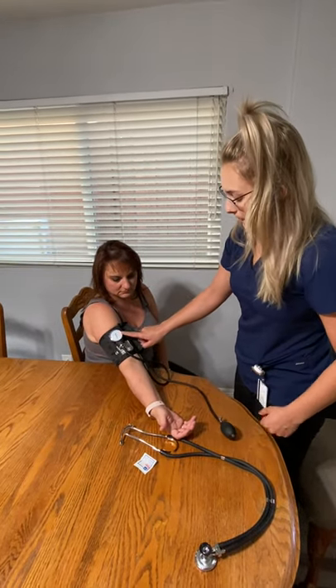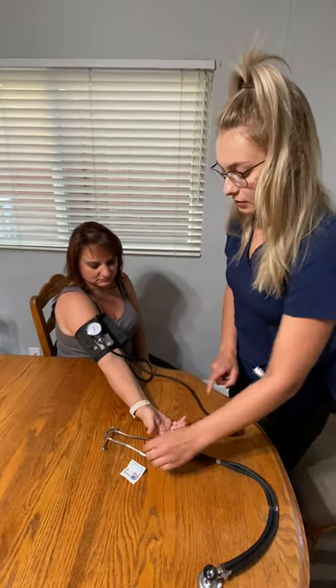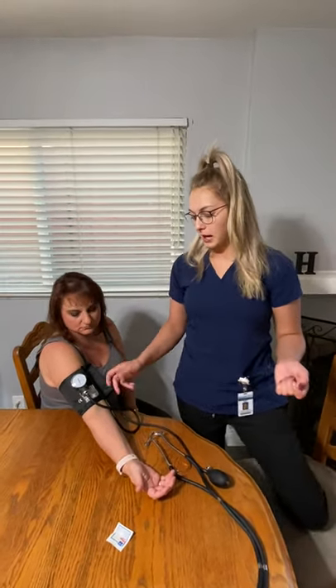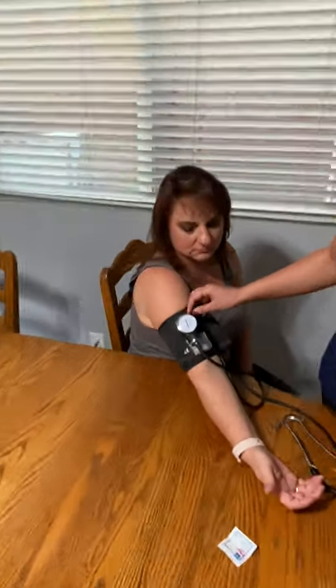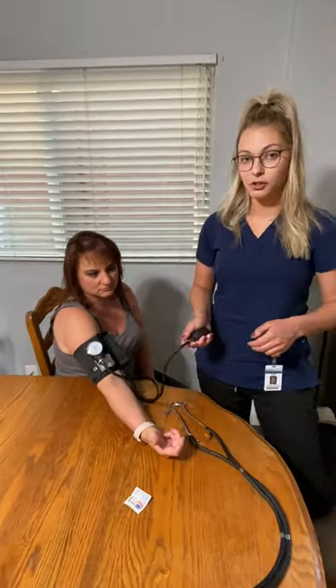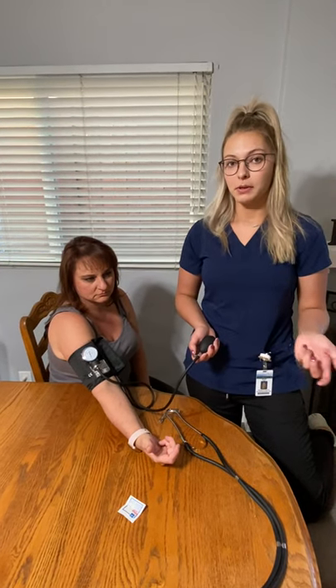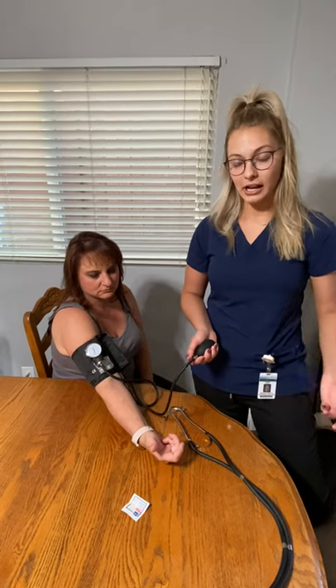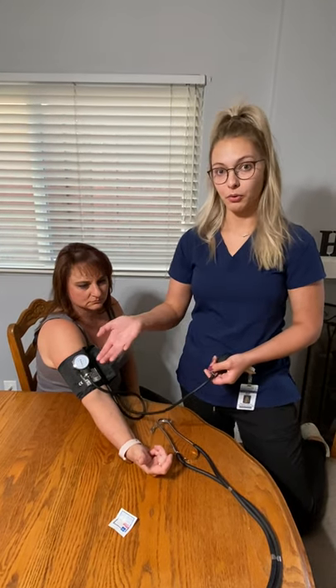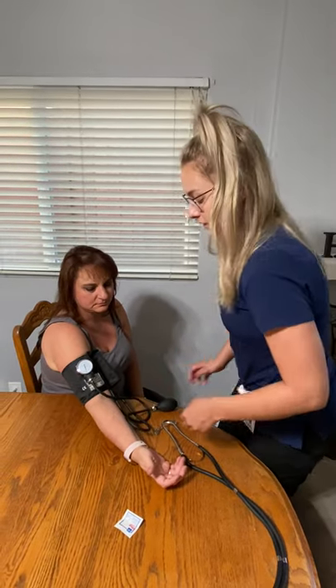We have our sphygmomanometer in place and the artery is in line with the arrow. To read a blood pressure, you pump it up — I usually go to about 180 to 200 mmHg — and then you slowly release. The most important part is slowly releasing the nozzle. When you hear the first thud, that's when you start recording. On the test, I believe you can miss up to 8 mmHg higher or lower.